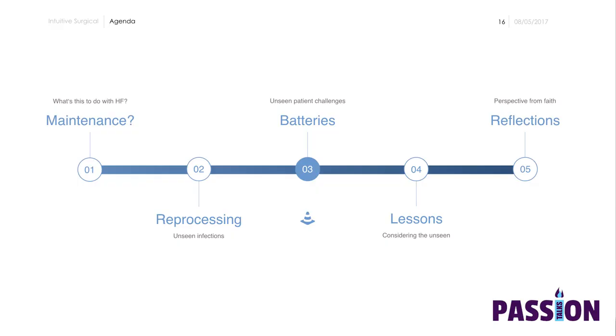The steps shown on the right are some elaborate steps for another product they developed to be able to culture and see, okay, is there really bad bacteria left on your device? It's just to illustrate it's not easy for our users to tell that they've done their job completely.